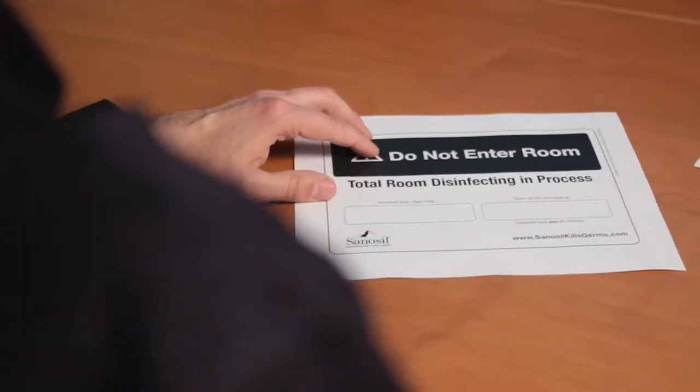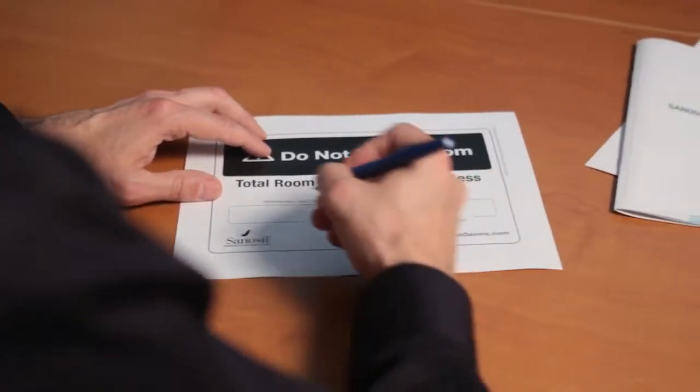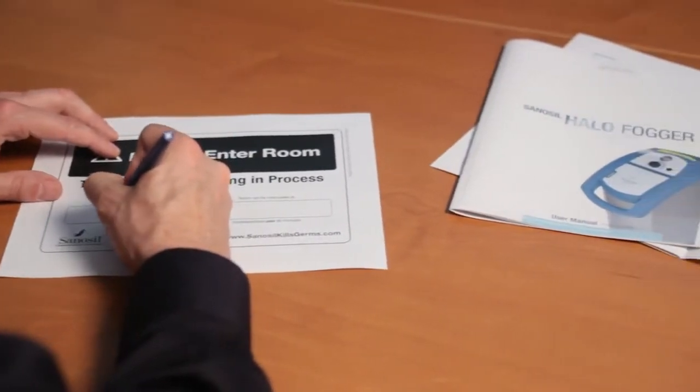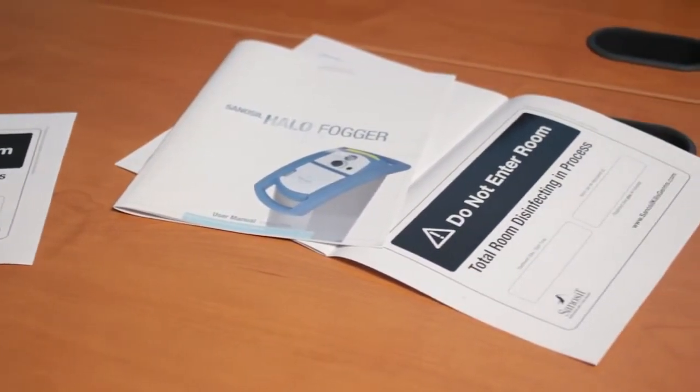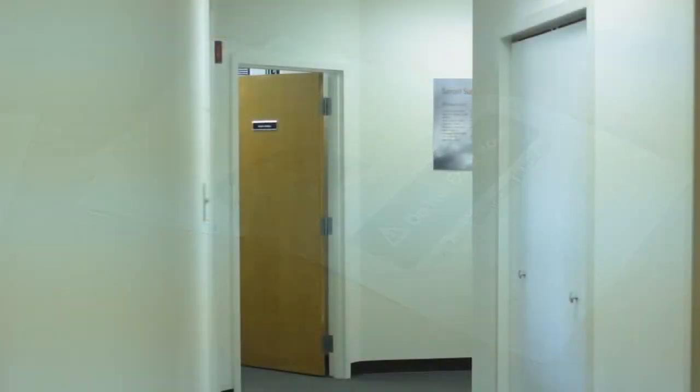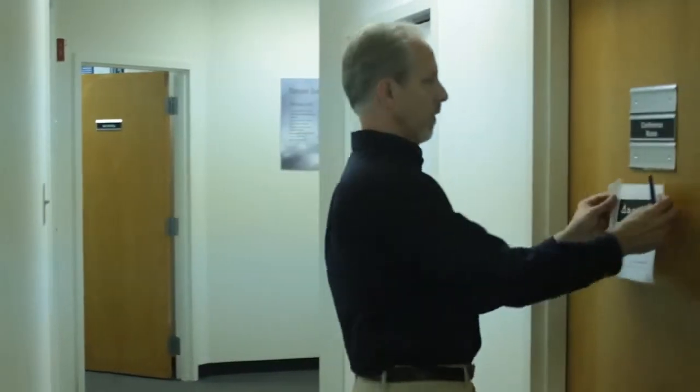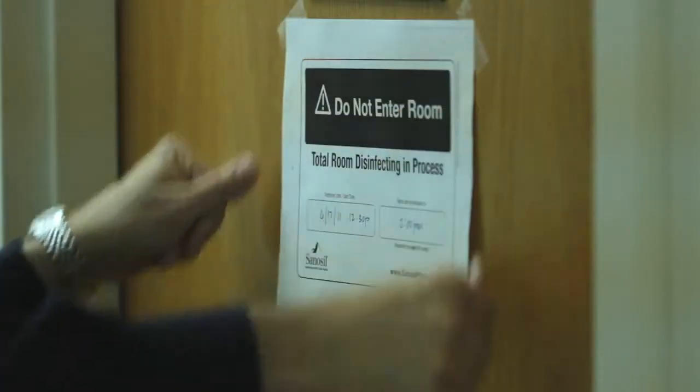Sanosil recommends a sign be posted outside the room being treated to inform others that a disinfecting procedure is in progress and that it is not safe to enter the room until the treatment cycle is complete. Sanosil has included signed artwork in the Halo Fogger user manual. Just fill in the blanks and post on the door.